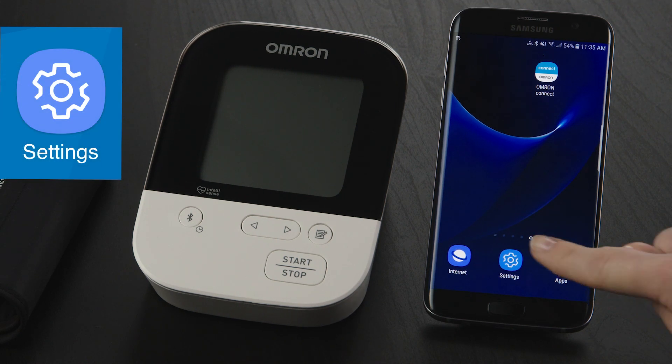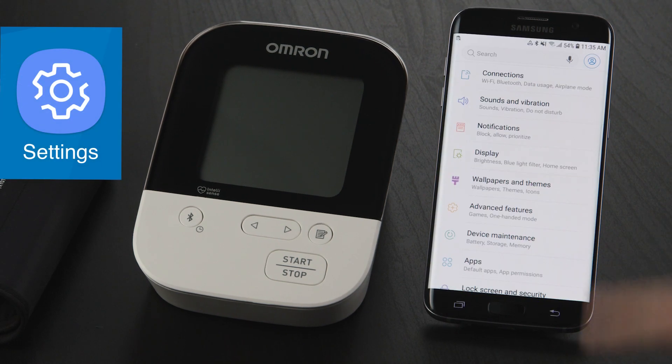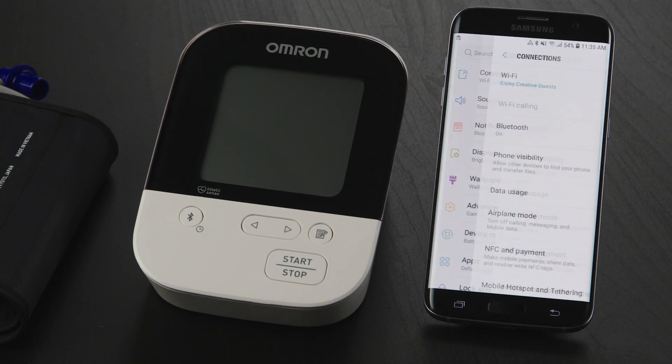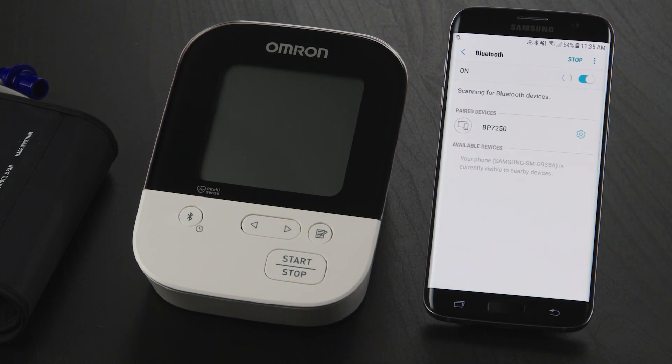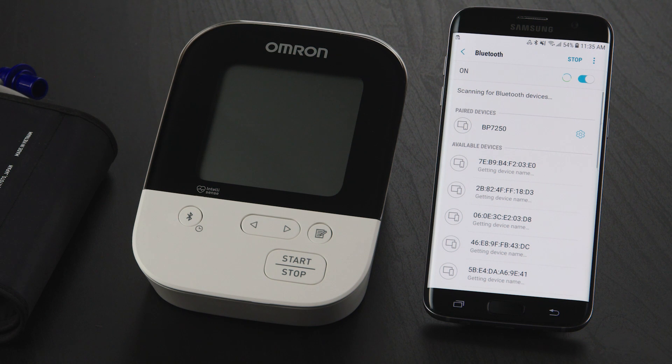First, navigate to your settings and tap on the Connections button. On the new screen, tap Bluetooth to access your paired devices list. You should see a list of paired devices.